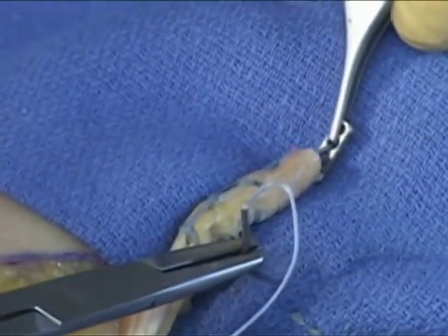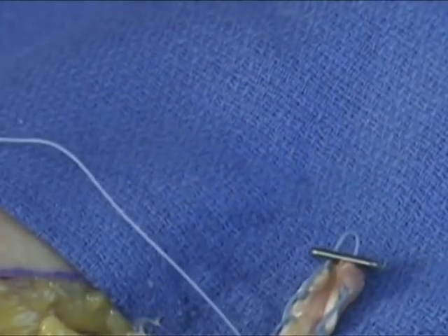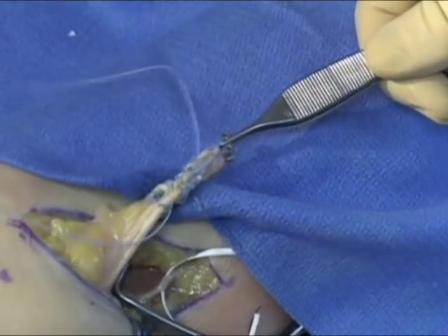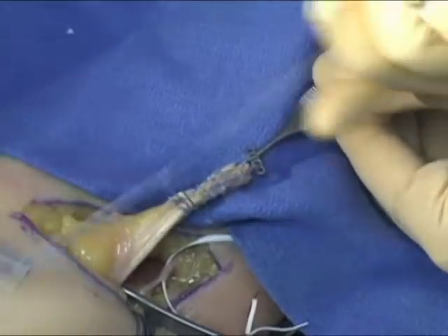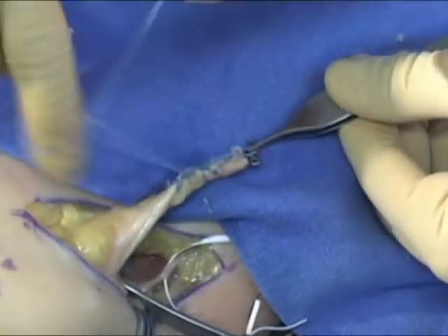The remainder of the locks are created and the first suture is firmly tied. A second suture is placed at approximately a 90 degree angle to the first suture using number five fiber wire material. It is passed through the same two endobutton holes and brought back along the opposite end of the tendon. In this fashion, two stout sutures have been placed through the tendon in a locking fashion and through the endobutton, leaving a 5 mm gap to allow the endobutton to toggle. The suture can then be cut and the tendon repair inspected.